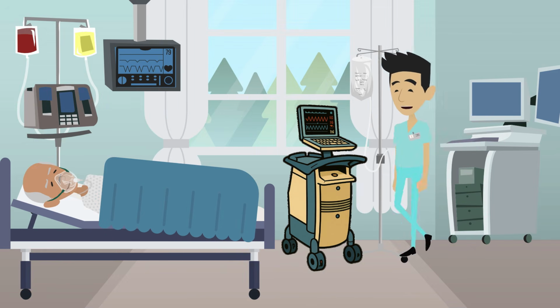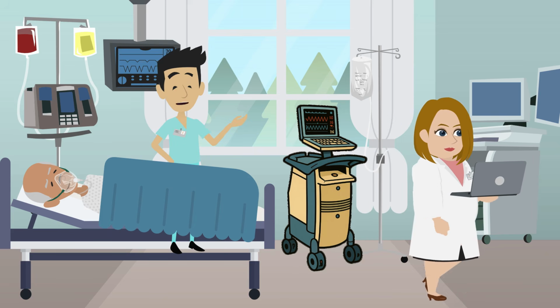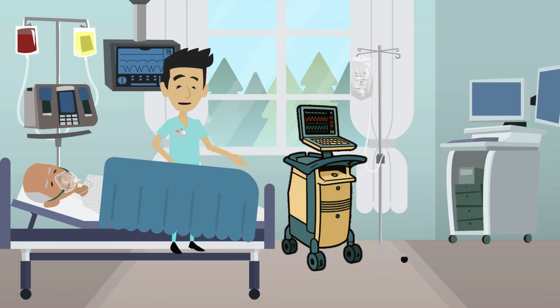One more thing, there are 2 clinical conditions that can make helium diffusion happen more rapidly. This includes if your patient is febrile or tachycardic. These 2 conditions cause helium to diffuse more rapidly and may trigger the gas loss in IAB circuit alarm. It is also important to assess the patient, patient-related contributing factors, and the IABP system for any changes that may be contributing. If these conditions apply to your patient, consider initiating a manual fill before the scheduled 2-hour autofill. To do that, remember to press and hold the IAB fill key, then press start to resume therapy.